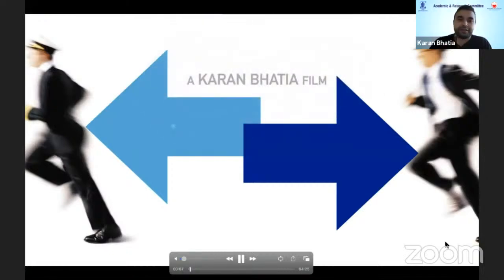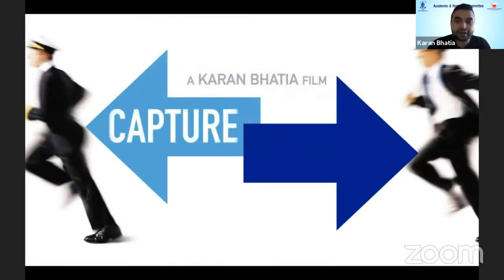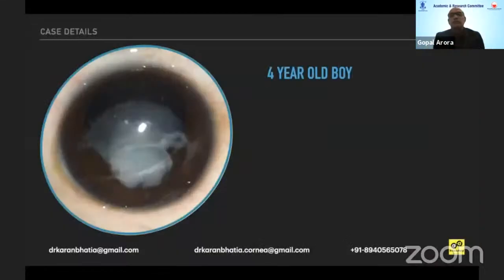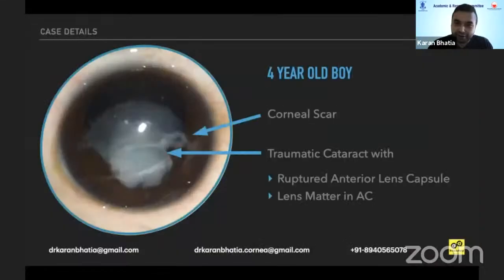So this was a case of a pediatric traumatic cataract. That's why I've labeled it "Capture If You Can," inspired from the movie "Catch Me If You Can." This was a 4-year-old boy who presented with a corneal scar, a traumatic cataract with a ruptured anterior lens capsule and lens matter in the anterior chamber.